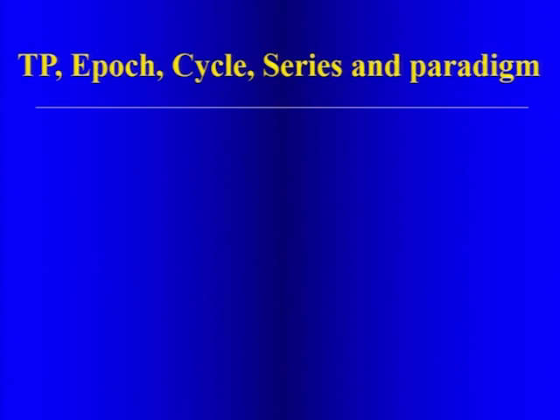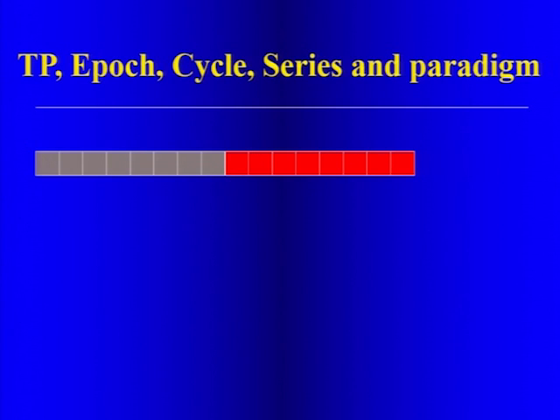So just to show you the time point, epoch, cycle, how all this works, in general, we are doing 10 time points now, so this slide's a little old. We've changed over time, and we've looked at different time points and different TRs, but I'm showing you what pretty much works for us. So a TR of 2 works. Time points, we do, like I said, within 2 seconds, we do 14 slices.